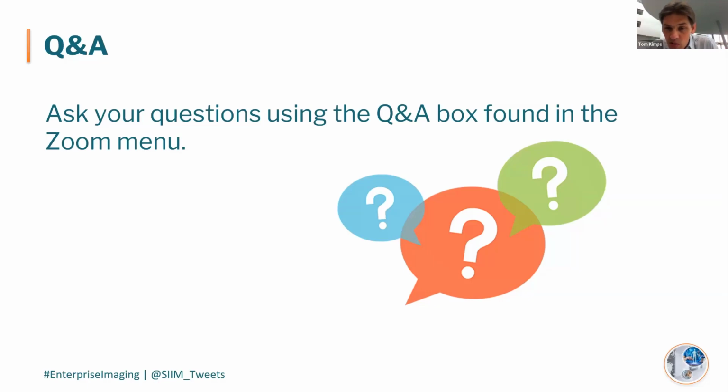I think these were most of the questions asked so far, but there are a few open ones. Maybe Brian, I think there is one on ambient light and its impact on the monitor, and how the monitor takes that into account. Maybe you can answer that one. It takes it into account. I covered it in the presentation, maybe the question came in prior to me covering it. The important part is that the calibration of a color calibration display starts with understanding what the ambient light was in that room. If it exceeds that ambient light, the calibration is not considered correct. I would encourage you to go look at that webinar, because it shows a representation of how too much ambient light affects being able to identify structures on the screen.